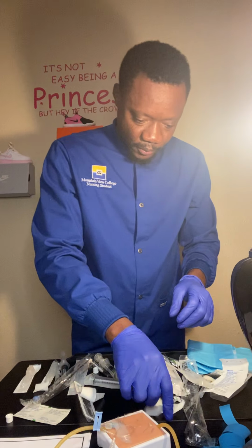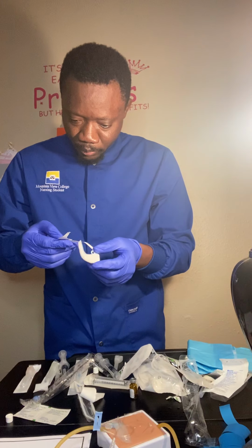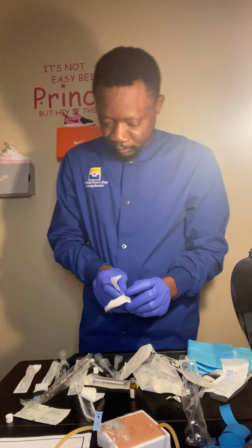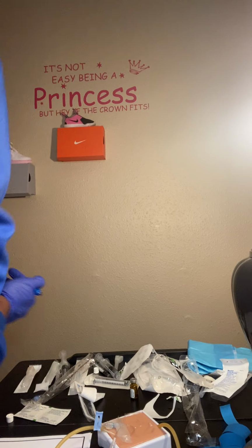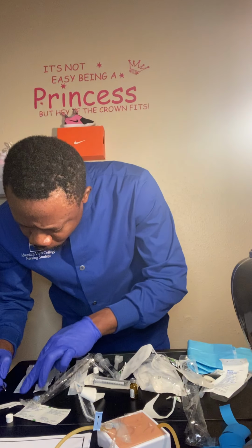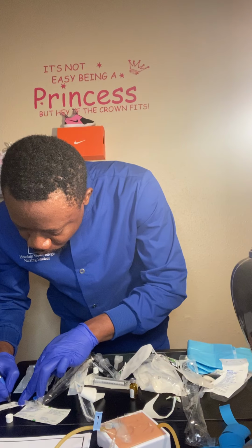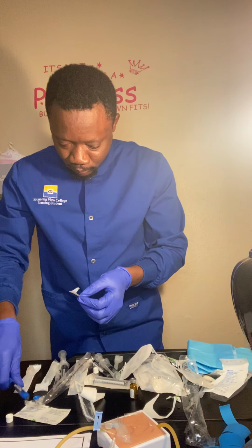So then I will write my initials, date, and the gauge I used. So write my initials, and the gauge I used, 22 gauge.